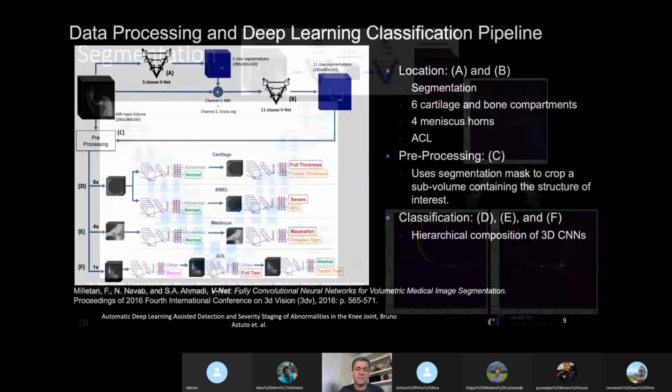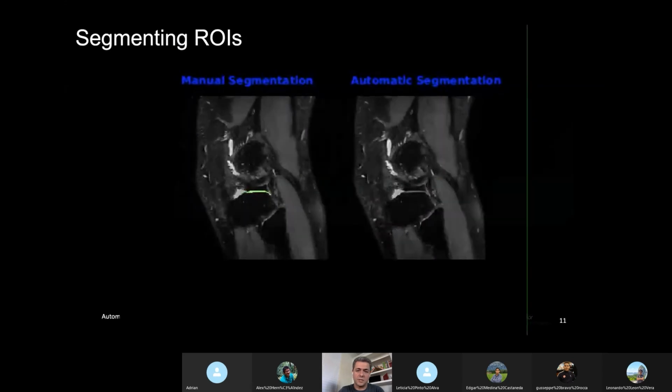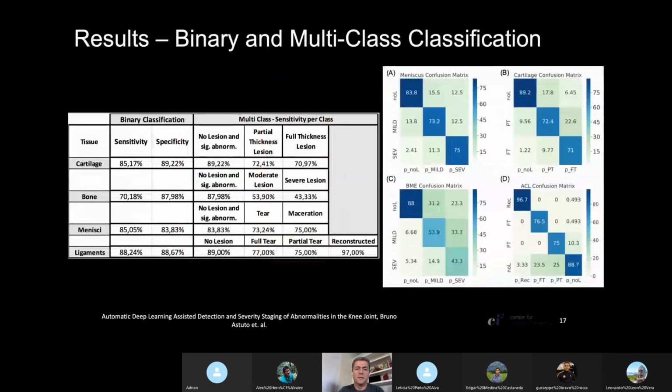The reason we look at sensitivity and specificity rather than just accuracy is that if I train a model that says 90% of the time it's a no lesion, 90% of the time it's going to be right. But that's not necessarily a good thing, because the positive events are rare. Not sure if I answered the question. Yeah, I got it.